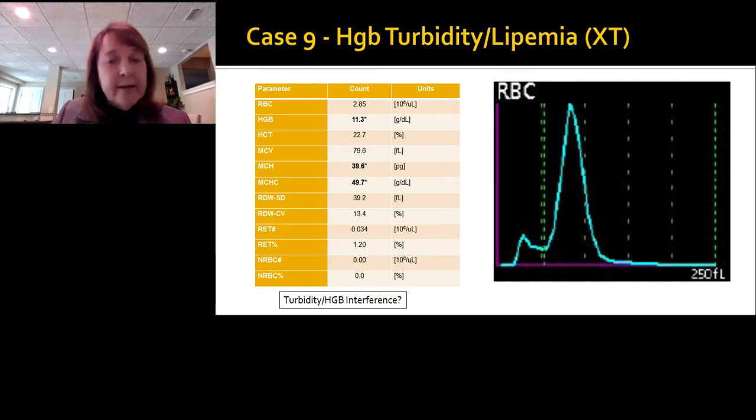Hemoglobin is a protein, and as such, it has a size to it. And as such, only so much hemoglobin protein can fit within the size of a red cell. Consequently, hemoglobin analyzers typically pick a value, and with that value, you know the maximum amount of hemoglobin that can fit into a red cell. For most analyzers, this is about 37 grams per deciliter of hemoglobin.